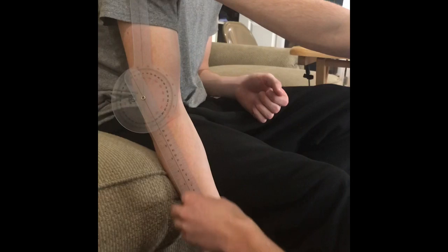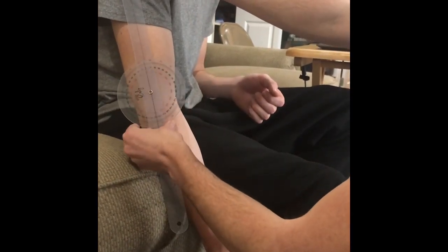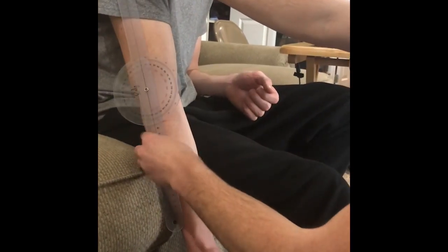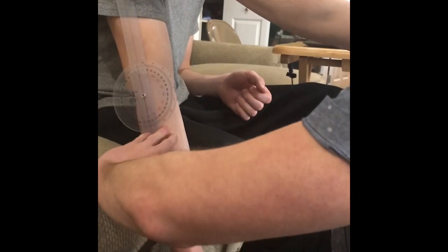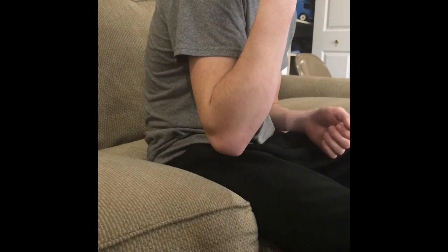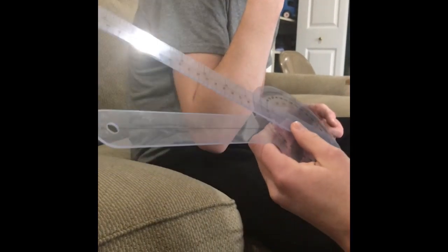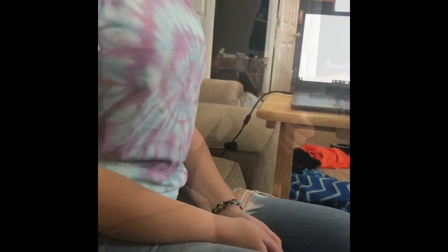And it's also important to note that when you're doing the range of motion, you're starting at 180 degrees here and moving it back to center. So you might have to do a little mental math. All right, when the patient is ready, you're going to have them flex upwards. Keep going. Yeah. And go all the way right here. All right, and there's 30 degrees left, which means that the patient moved 150 degrees.